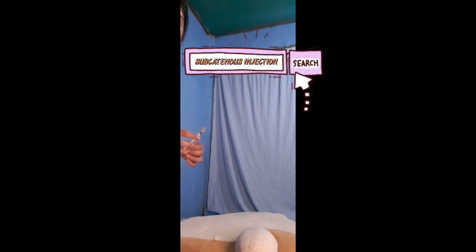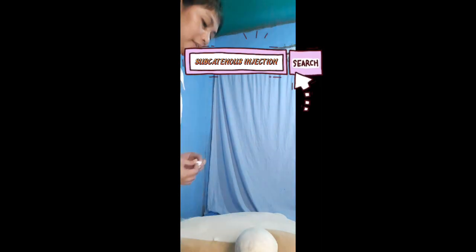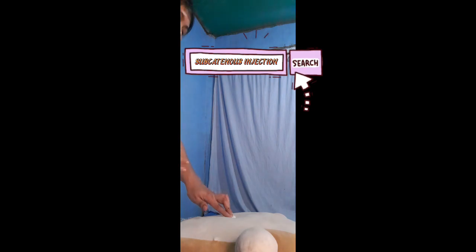Next, we are going to get the cotton balls. Do not massage the area that we injected, to avoid irritation or infection. So that will be all of the subcutaneous insulin injection.